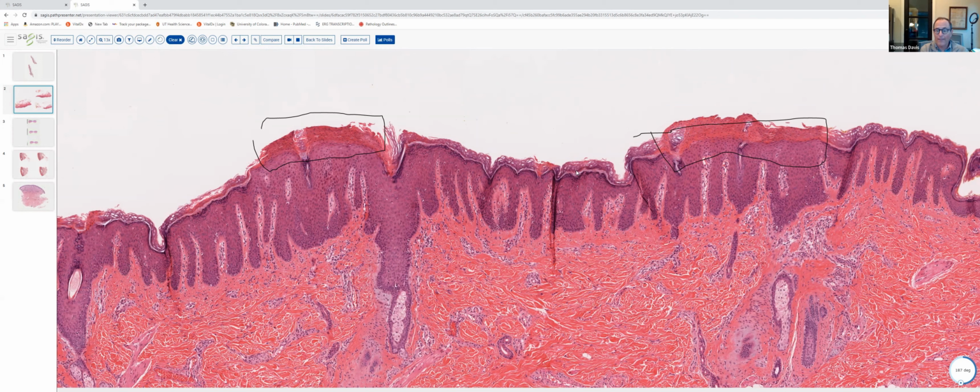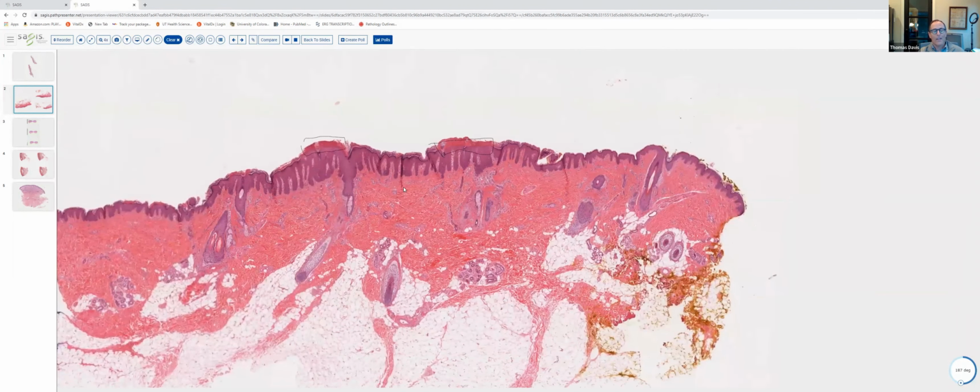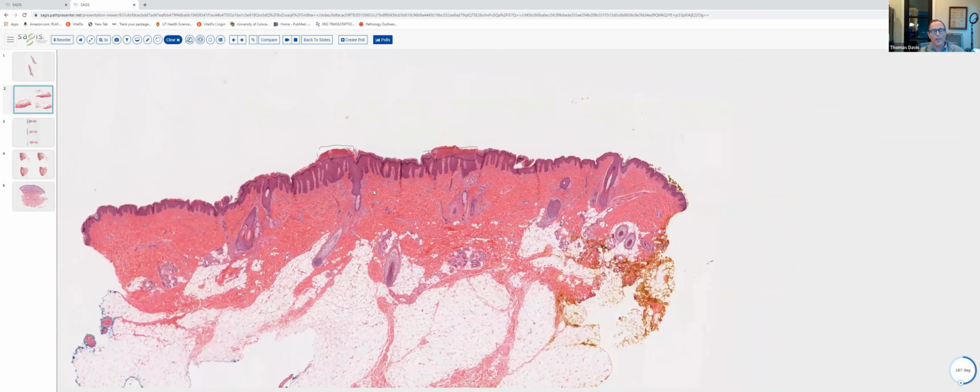And you'll remember that the parakeratosis that one sees in the setting of PRP is more staggered with horizontal and vertical orientation, rather than these discrete full thickness zones of parakeratosis that one sees in ILVEN. So our second case, inflammatory linear verrucous epidermal nevus.